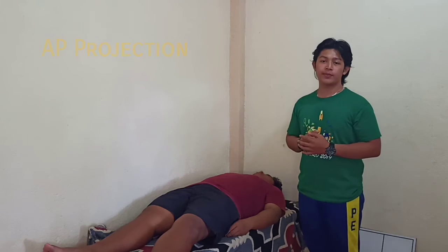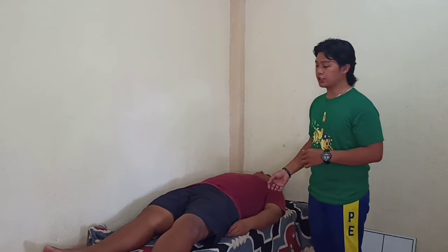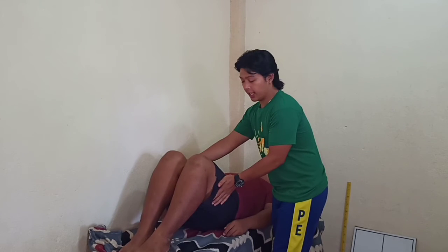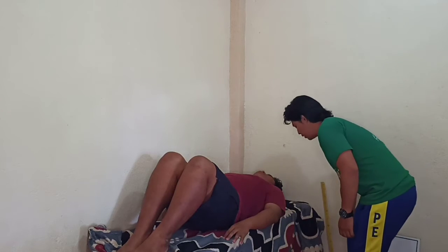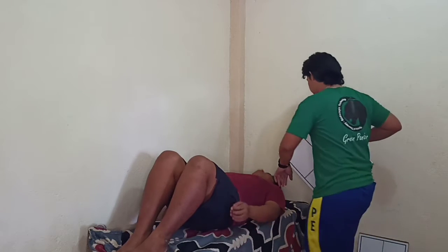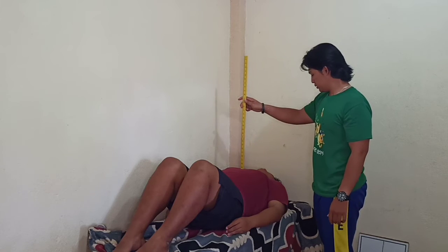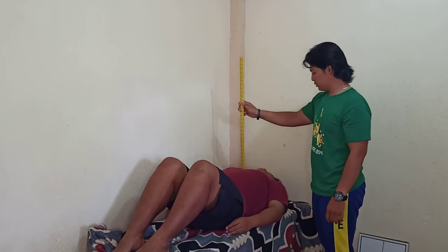And now, we are going to discuss the different projections of the thoracic vertebra. The first projection is the AP projection. First, place the patient in supine position with the hips flexed to reduce kyphosis, and the thighs flexed vertical. And use 14x17 image receptor and center the image receptor at the level of T7. And the central ray must be perpendicularly directed to the image receptor between the jugular notch and the xiphoid process. And the structure shown in this projection is the 12 thoracic vertebrae.